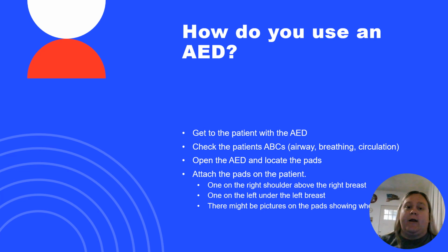So on all of the pads, or most of the pads that I have come in contact with, they do show you where to go. Again, back to that whole picture thing, right? Okay, but we're doing this refresher course to get out of being dependent on those pictures and those voices, right? So we're going to attach the pads. Where are we going to put the pads?